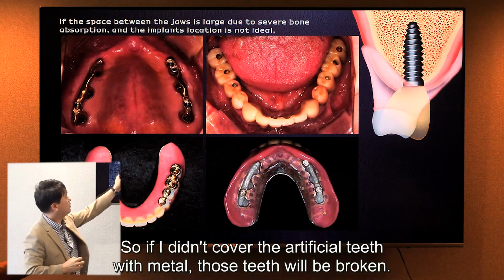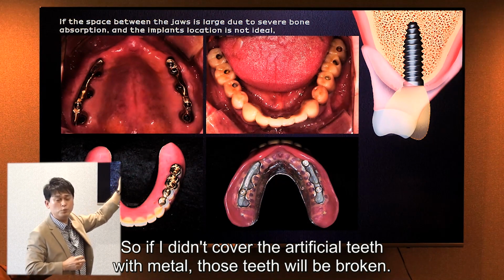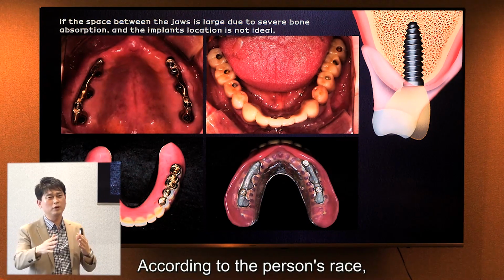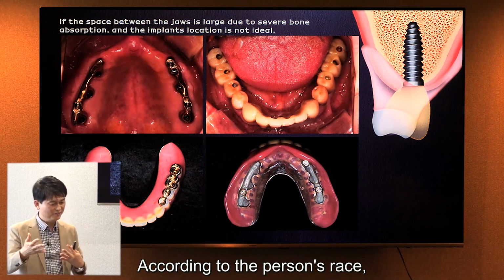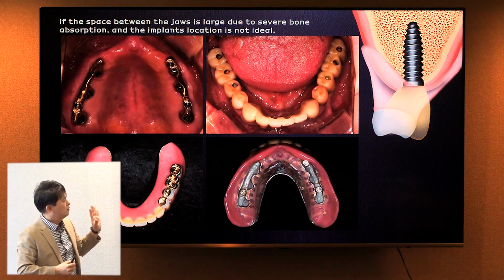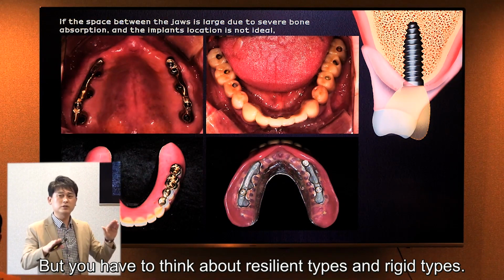So if I didn't cover these artificial teeth with metal, the artificial teeth would be broken. So according to the people and race, the treatment will be different. Anyway, you have to think about the resilient type and rigid type.